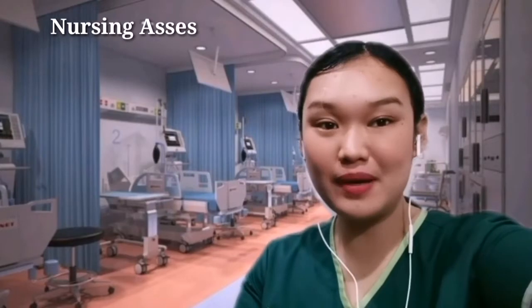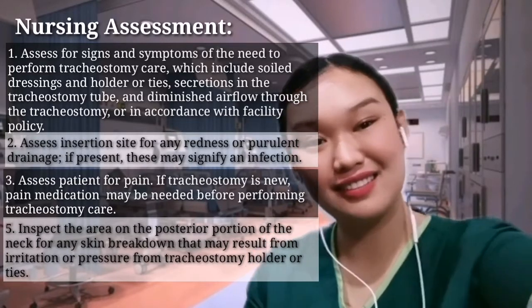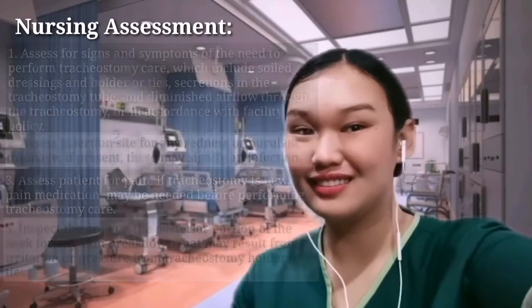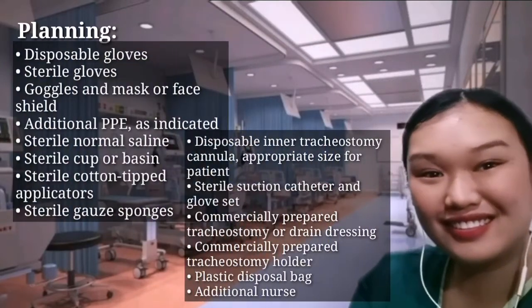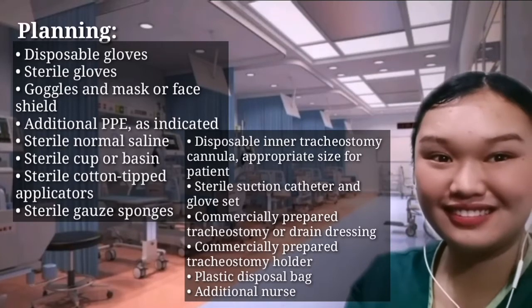Now for the nursing assessment, we have 4. Now for planning, we have to gather and prepare the following materials. Now let's move on to the procedure or the implementation.